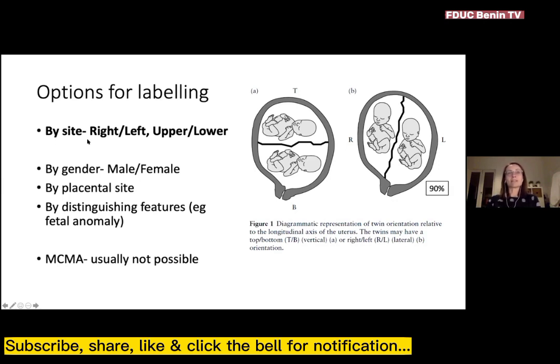So the best way to label a twin pregnancy is by the location of each twin within the uterus. So usually the most common scenario is that they're situated on the right or the left, and once the gestational sac and placenta has implanted in that location, it's not going to move. So the twin's not going to move from the right side of the uterus to the left side and vice versa. About 10% of pregnancies, the implantation is actually in an upper and lower orientation.